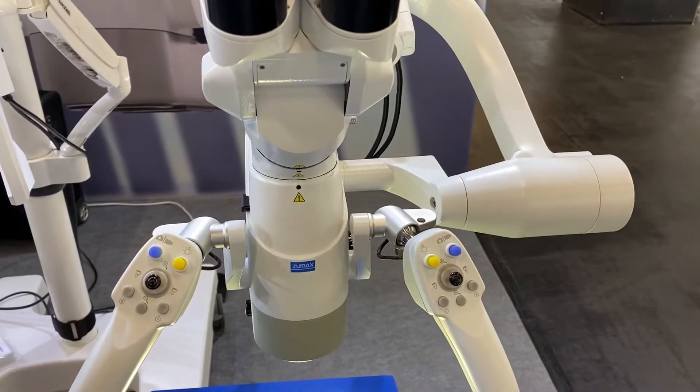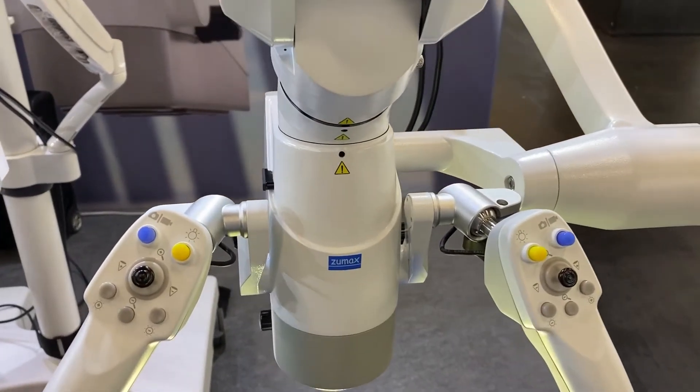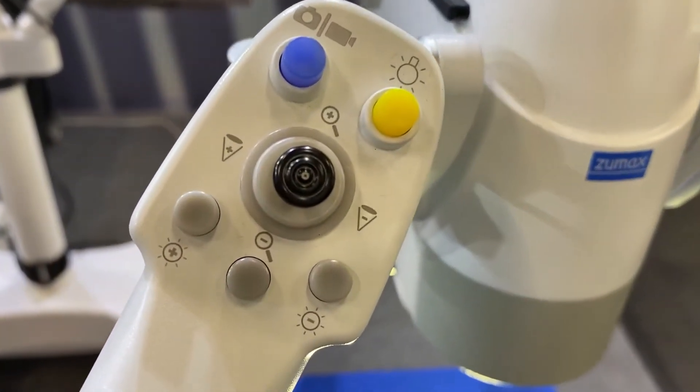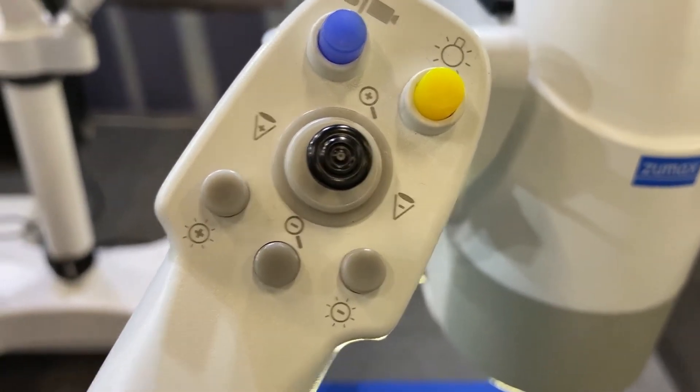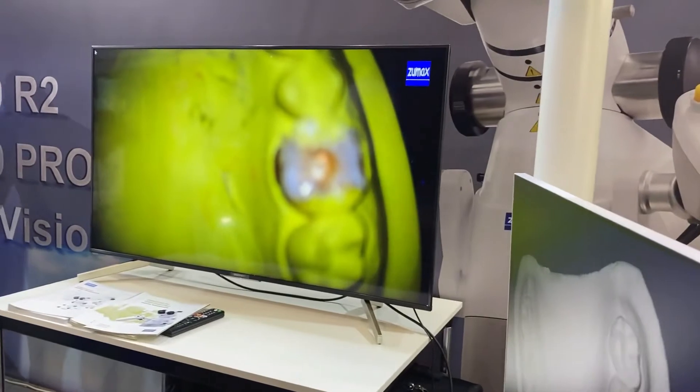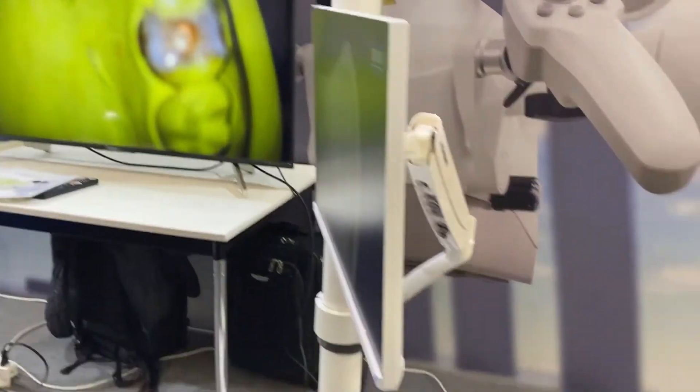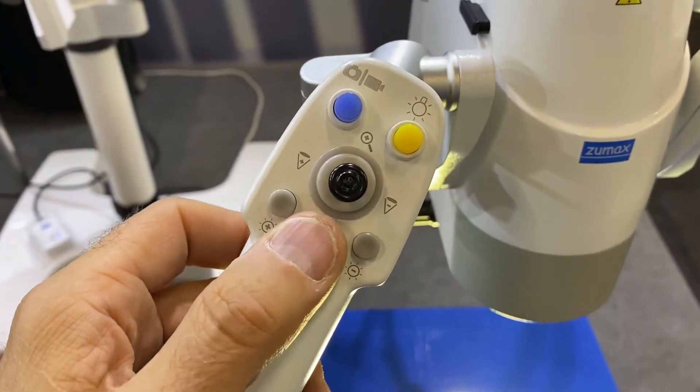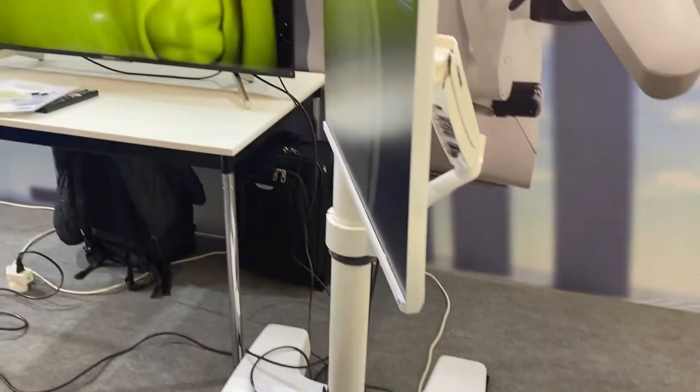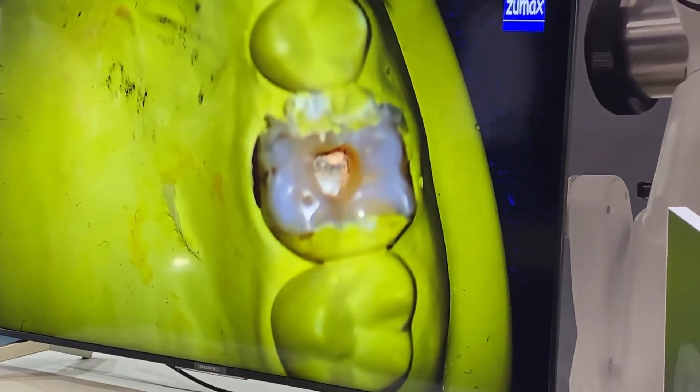And another thing which is new here with this OMS3200R2 is the motorized automatic focus. So basically I took, if you look on the screen here, I took the image out of focus and I will just press this button here one time short and the microscope will automatically bring the image into focus.